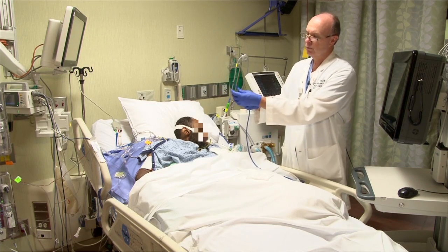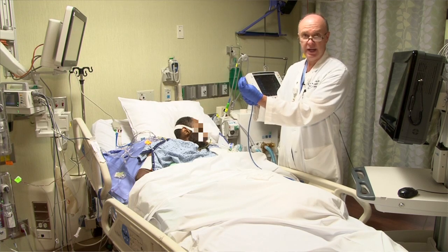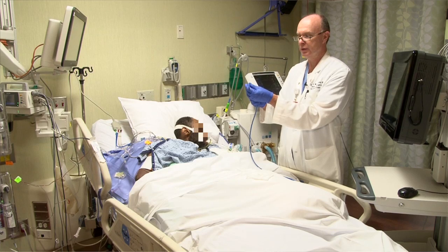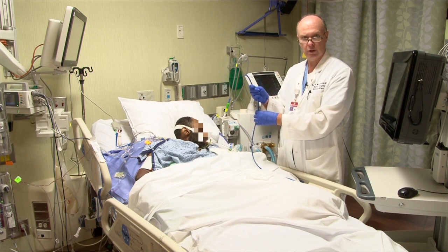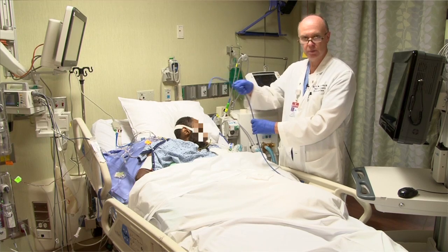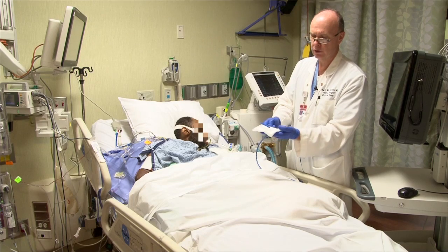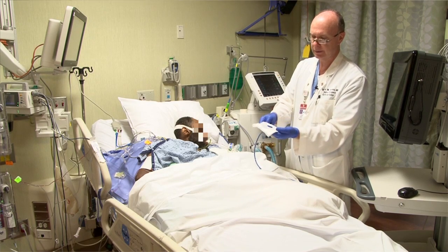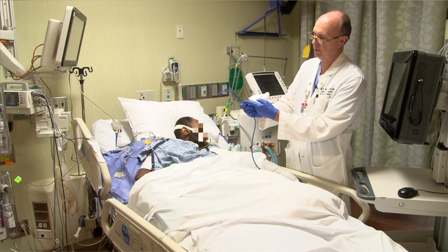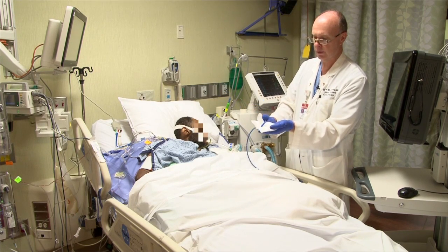This probe is very flexible on the end and can be easy to insert, but it can also curl a little bit in the mouth. So insertion movements that are small — just like you would insert an NG tube — are more helpful, as opposed to taking the probe and pushing it into the mouth in one large motion. We do need to use some lubrication, and I usually lubricate about the first 20 centimeters. This is about the 20 centimeter mark here, just to help us get it through the oral pharynx.